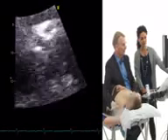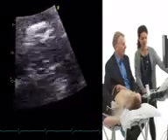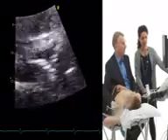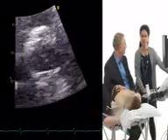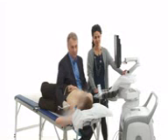Yeah, but honestly, I would not rely too much on just a 2D image to quantify aortic stenosis, but one thing is clear, I would expect at least some degree of aortic stenosis. Do you agree? Yes. Okay, and I think this is the first very important finding in this patient. Don't you see very similar features between the patient we just saw and the one I presented as the first case in this lecture? Well, maybe the patient has aortic stenosis.